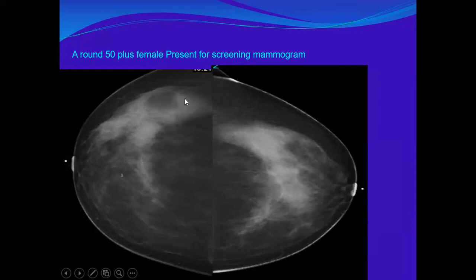You see? The patient was not cooperative. That is why her mammography was not an optimum one. I told you, she didn't like to do that mammogram from the beginning. From the clinic, the physician was pushing her. And when she came, she was hesitating to do the study and very uncooperative. I spent a long time convincing her. I remember that patient. It's since 2014, but I remember as if it were today. After her physician convinced her, and I convinced her, we found two tiny malignancies. That is why I could remember her.